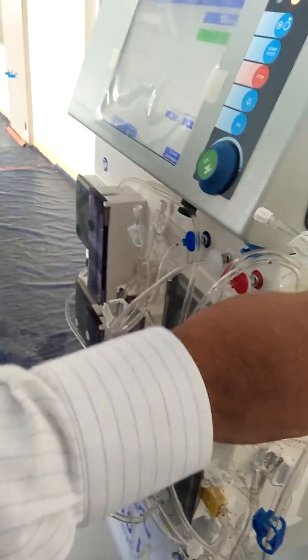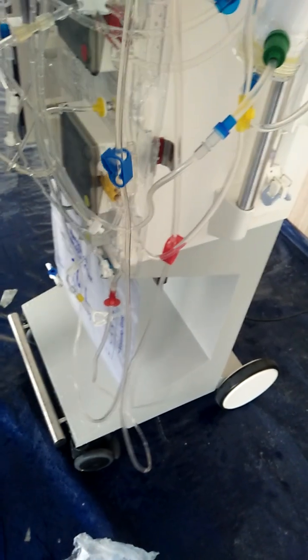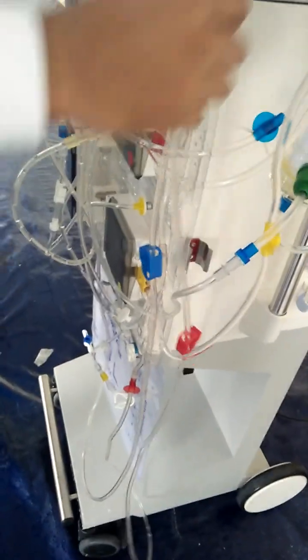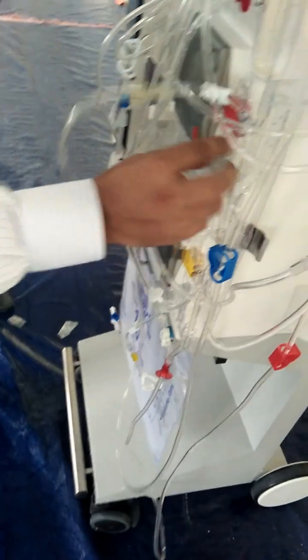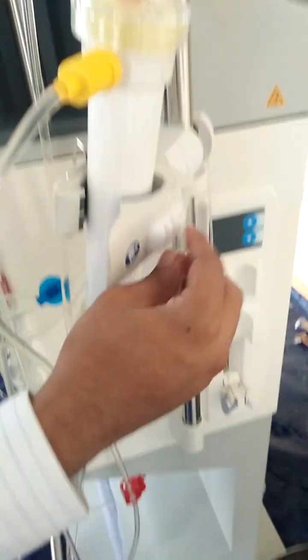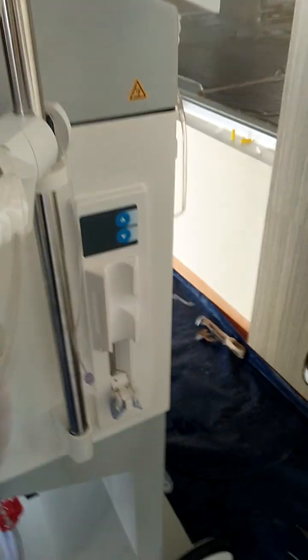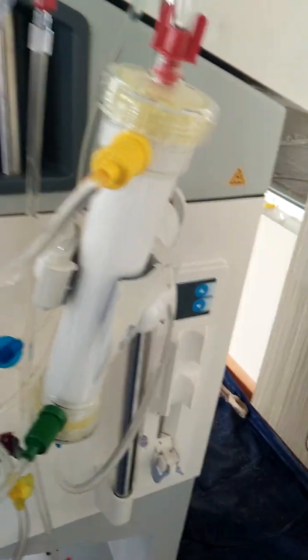No, you need to explain to us. This is the patient, right? Yes, that's the patient. So from the artery, the blood is from arterial, going to here. So blood pump, then arterial chamber, then to the dialyzer. Then from the output here, it's going to venous.